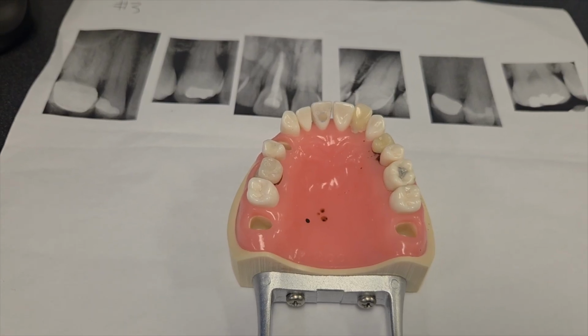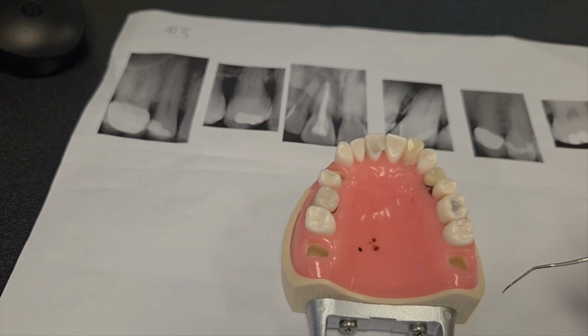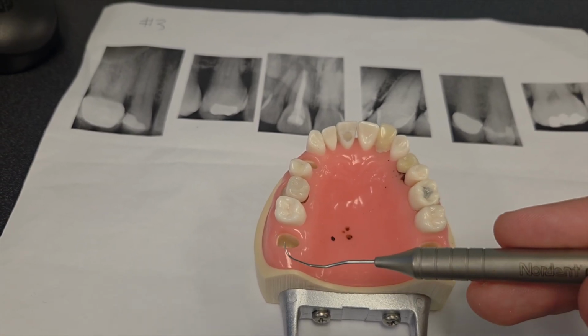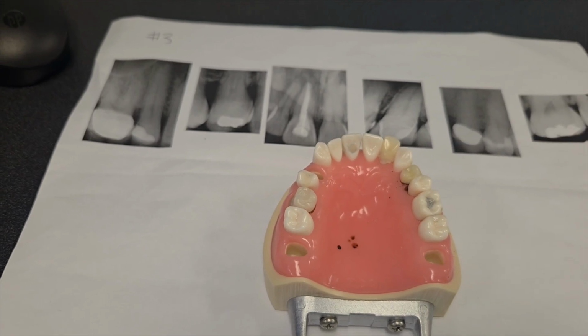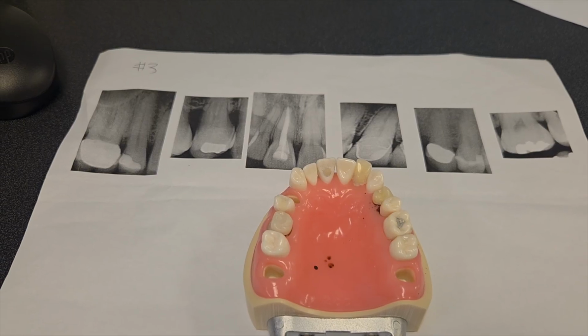So when dentition charting, the first thing that I'm noticing here is that this patient is missing some teeth. We're missing some third molars and we're missing a premolar here. So that'll be the first thing we're going to chart. And again, you can see that based off the EOIO alone.